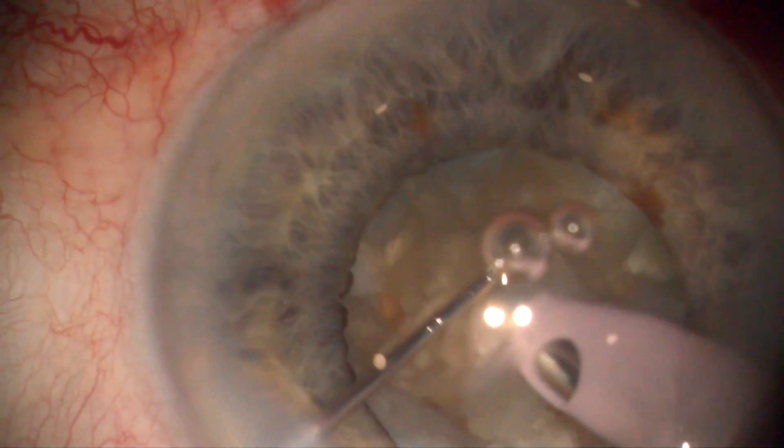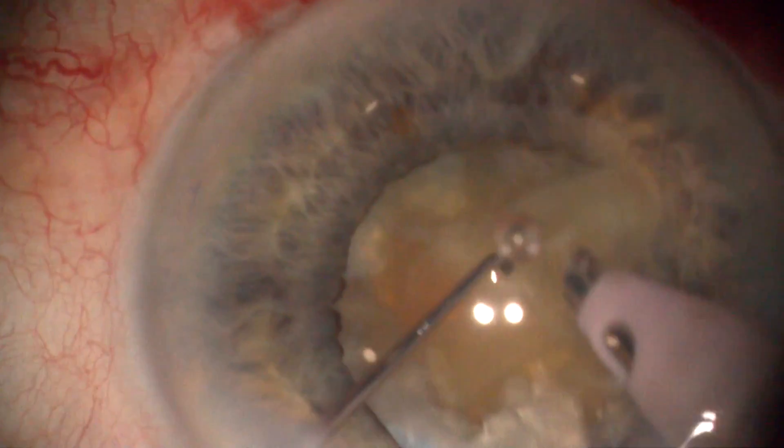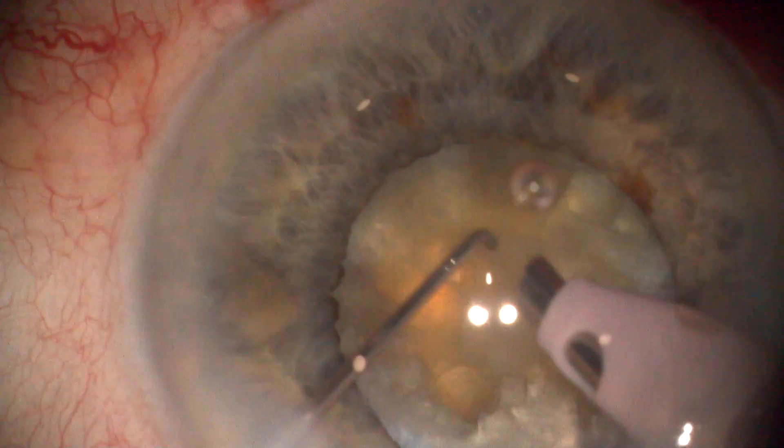Bevel-down titanium tip induces fragment rotation towards the leathery posterior plate. Bevel-down titanium tip directs the ultrasound energy cone out of the endothelium.